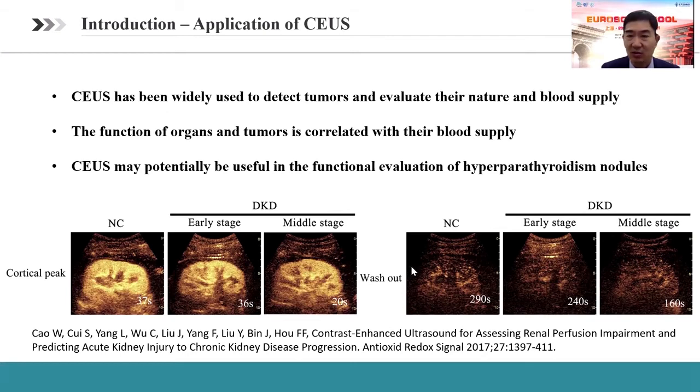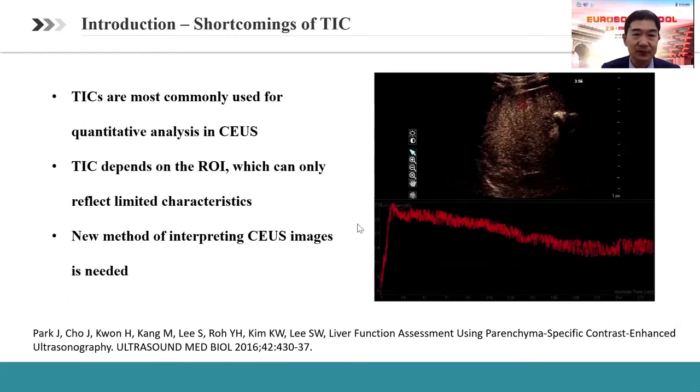But there is no obvious difference between the normal and diseased kidney in the later phase.